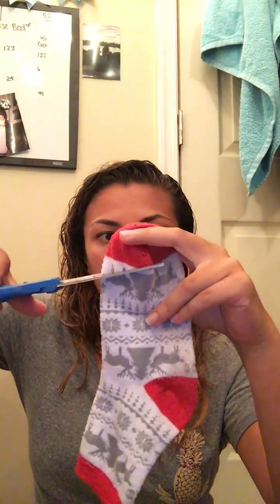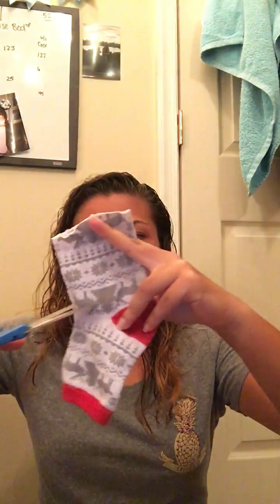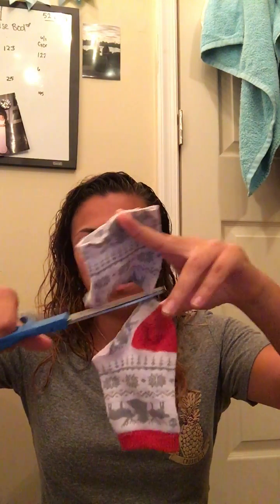Some things that I do, I'll get this off, to help it. You do wear this for a long time, and these pads can get really gross. So what I do, if I can find it, is use a sock. I don't know where my sock went. Oh, this right here. So you can take an old sock and cut the top off here, and then put that one at the bottom. So that one's covered there, and then with the top you just cut it along here. Make a slit in it, and we'll wrap it around that way.